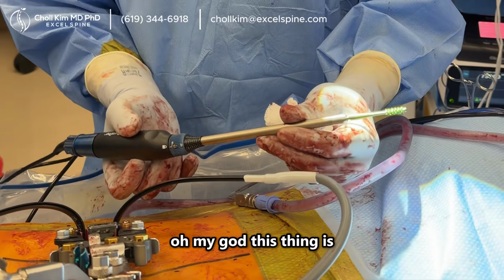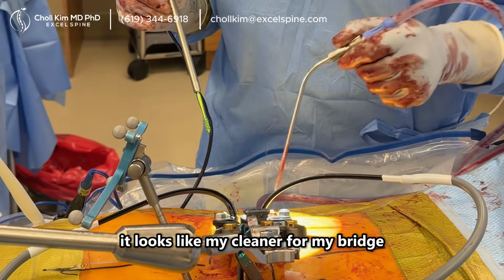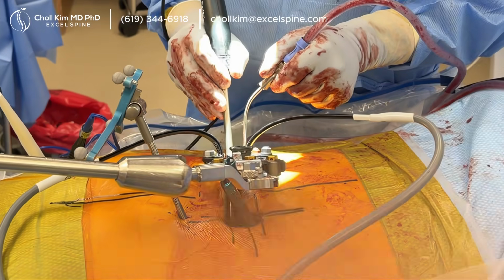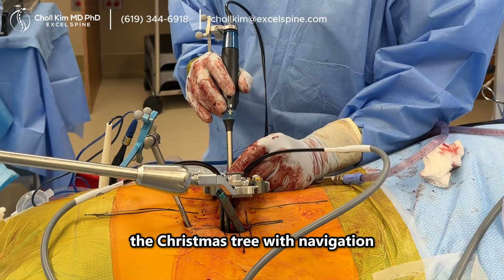Oh my God, this thing, it looks like my cleaner for my bridge. What do we call this? The Christmas tree with navigation.